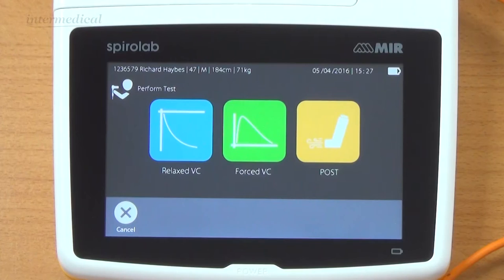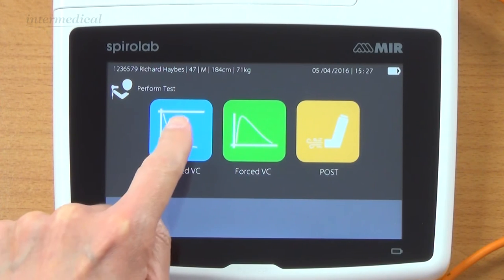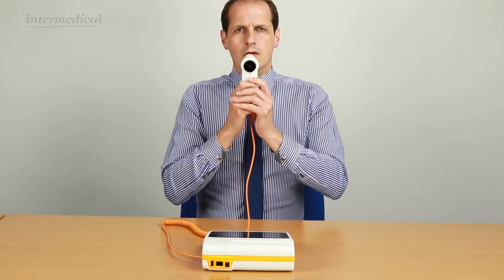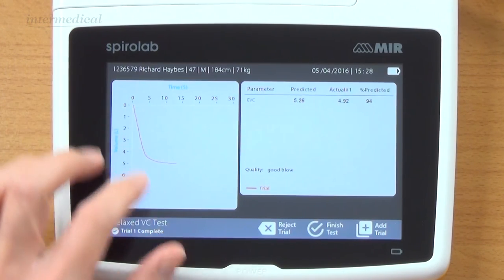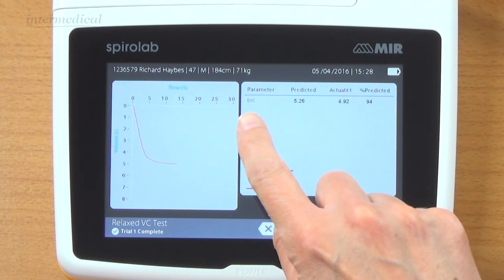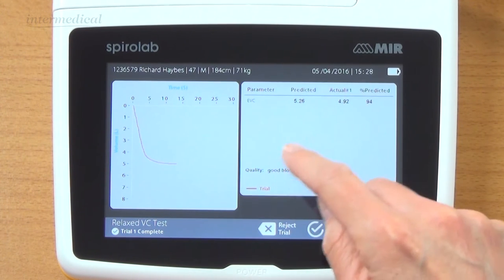On the screen we've got the option to do the relaxed VC, the forced VC, or a post-test. I'm going to click on the relaxed VC. It's now asking me to do my test - this is a relaxed vital capacity. You can see the graph comes up on the screen, nice and smooth and free from second breaths. Over here we get EVC - expiratory vital capacity - with predicted, actual, and percent predicted. And the quality of the test.